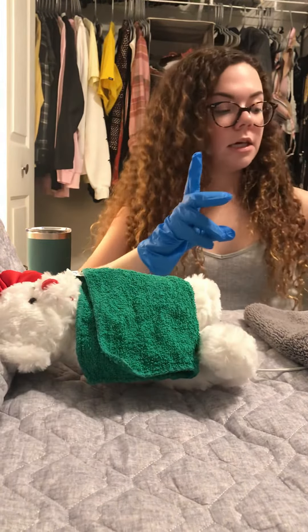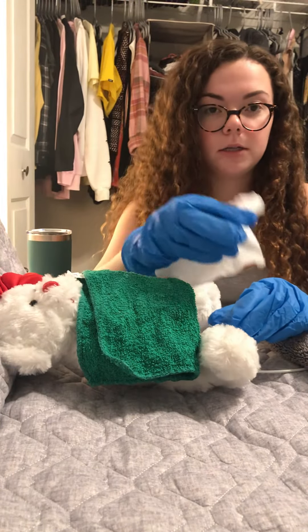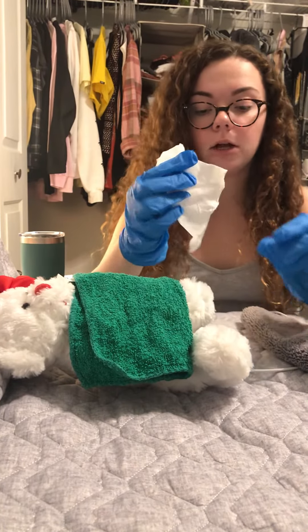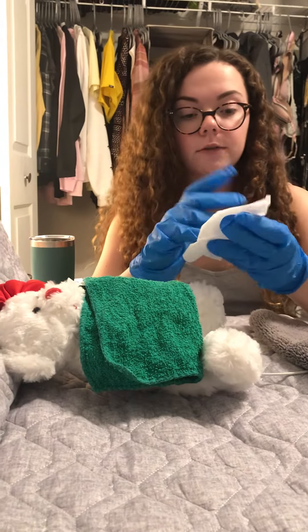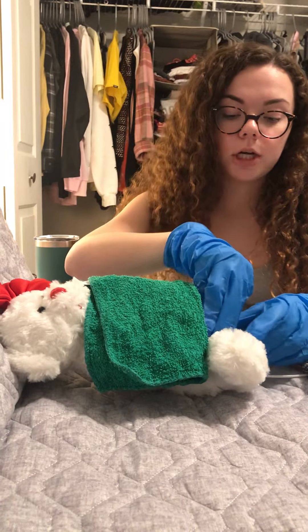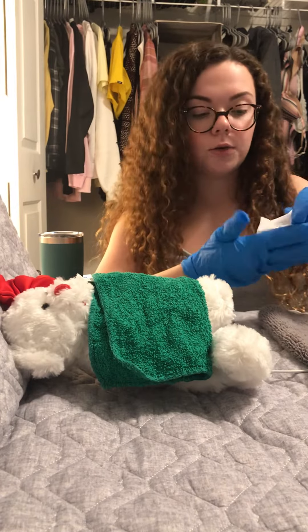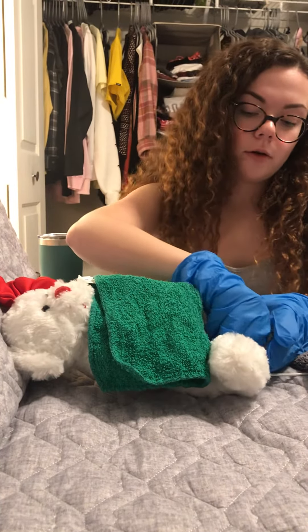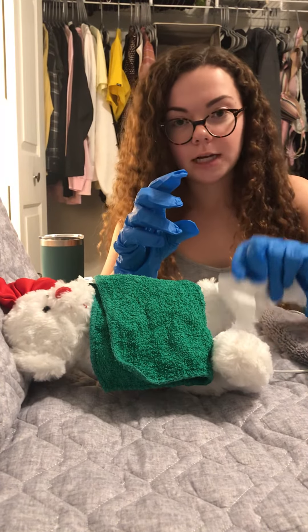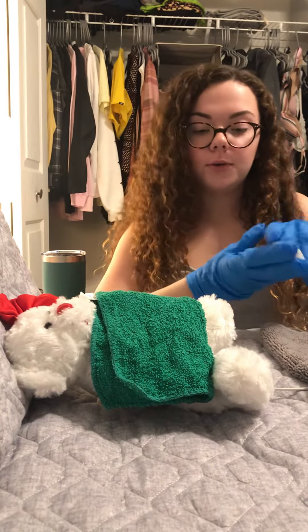I'm going to take a wipe and start with the tip of the penis, going down in a circular motion, making sure to keep that catheter in place and not move it. Then I would take a different part of the wipe or a new wipe and do the same thing, going down in a circular motion. Then I'd throw that wipe away, get a new wipe, and wipe down on one side of the scrotum, then use a new part of the wipe on the other side of the scrotum.